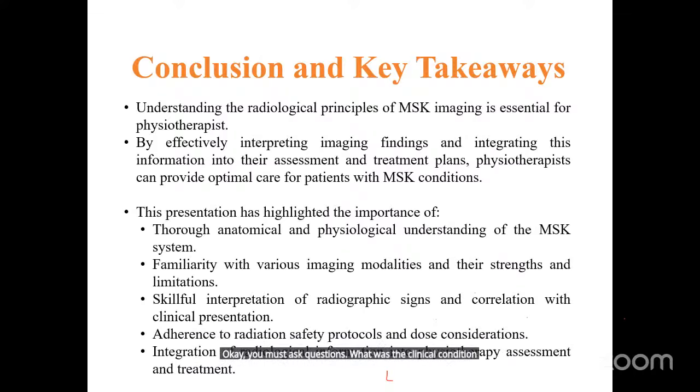What is the patient history before going into interpretation of radiological images? And you should be systematic in interpretation. The only way to be systematic is to use landmarks to help you in identifying cardinal structures that will give you objectivity in getting first-line impressions about your patient's conditions radiologically.